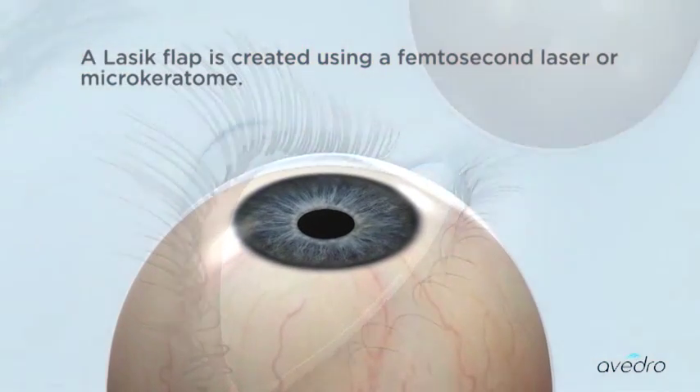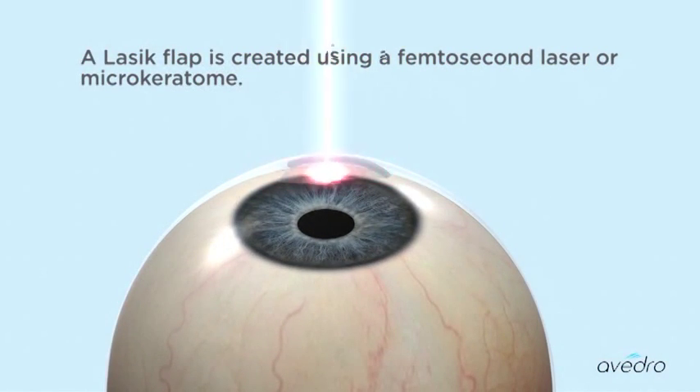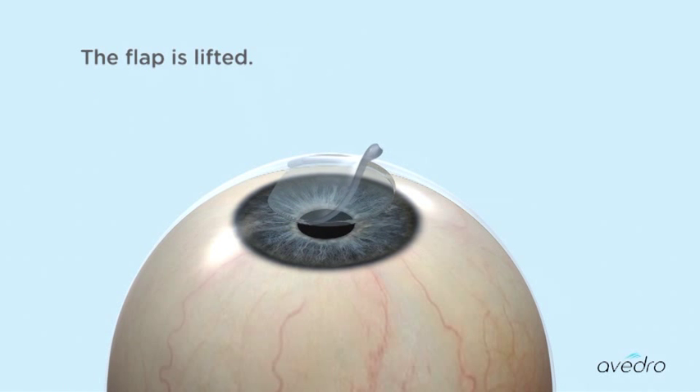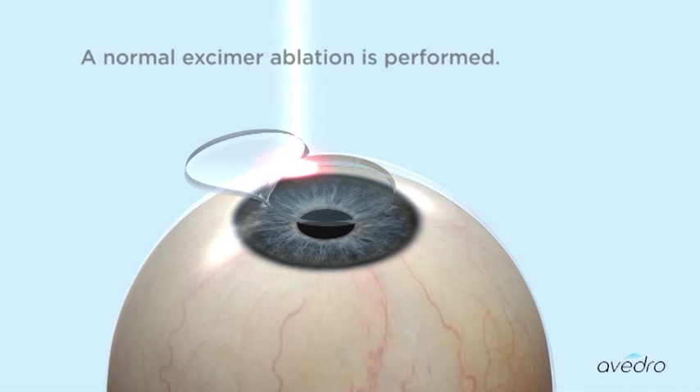A LASIK flap is created using a femtosecond laser or microkeratome. The flap is lifted, and a normal excimer ablation is performed.